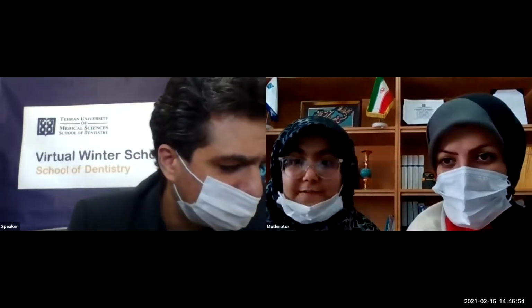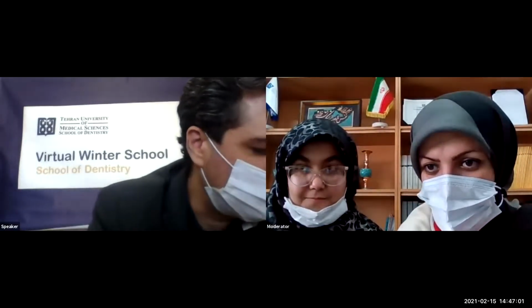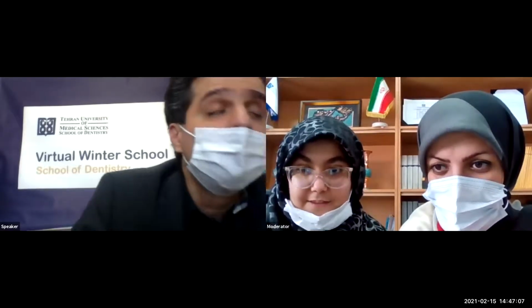There is another question. For determining the color, the background should be gray. Please repeat. Yes, sure. For determining the color, the background should be gray, or light blue or gray.